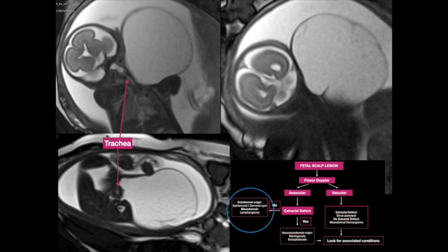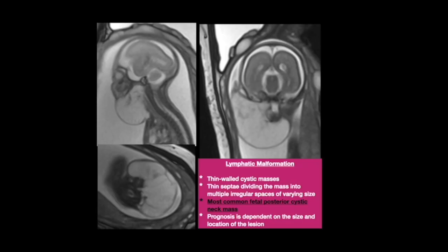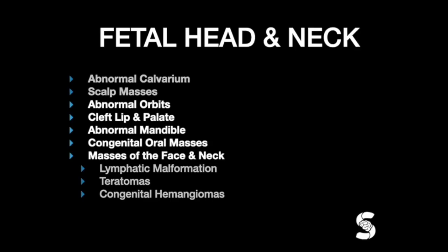Lymphatic malformations are typically located within the posterior subcutaneous tissue, although they frequently wrap around laterally and may involve only one side of the neck, causing postural abnormalities. This is another patient with very similar findings to the previous one. In this patient, there is a prominent hyperextension of the neck due to the huge cervical mass.